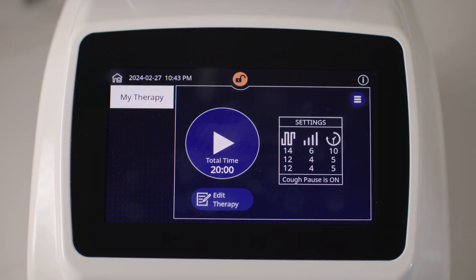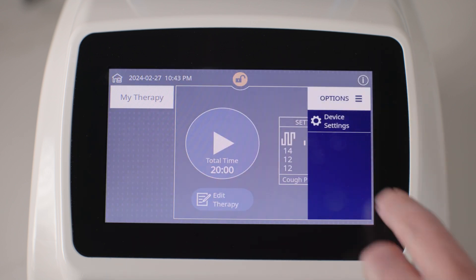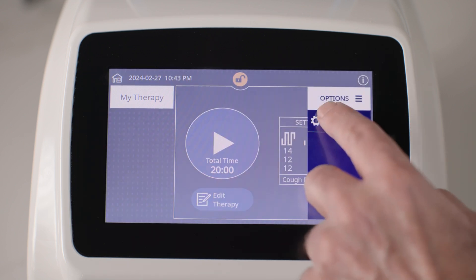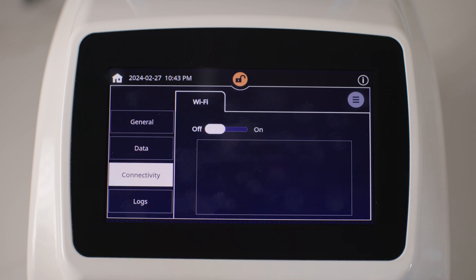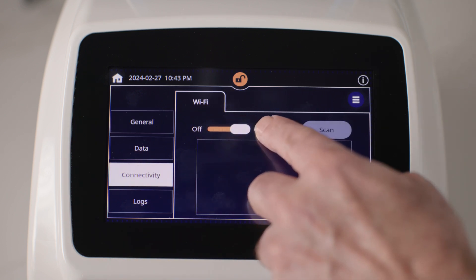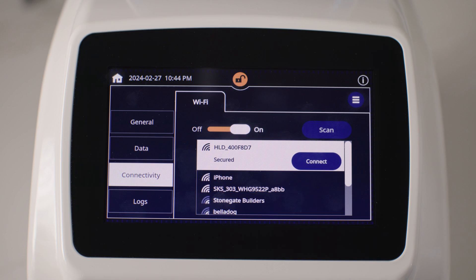To allow for connectivity on the VEST APX system, tap the options icon and tap device settings. On this screen, tap connectivity and drag the Wi-Fi slider to on. The device will begin to scan for available networks. Once the scan is complete, the list of available networks will be displayed. If it does not, or if you would like to rescan, tap scan.